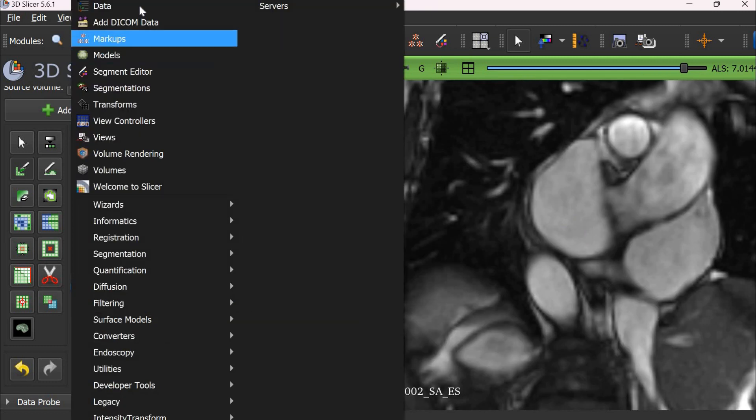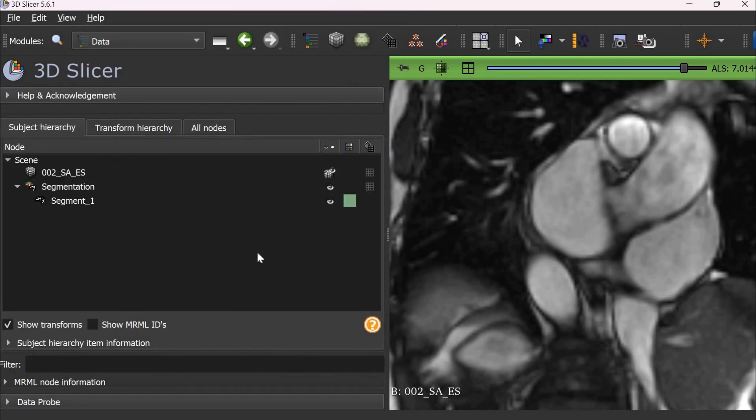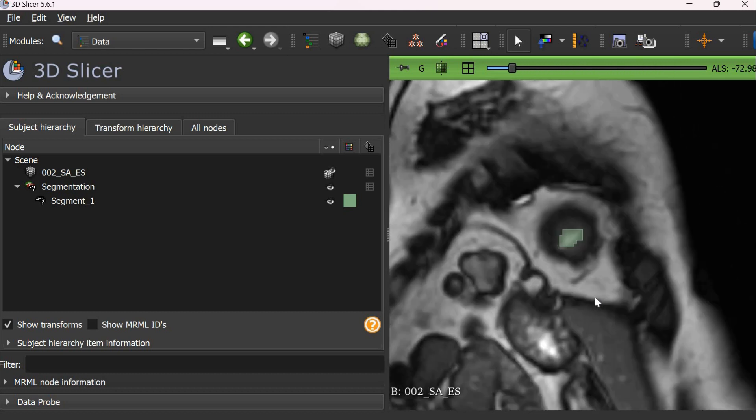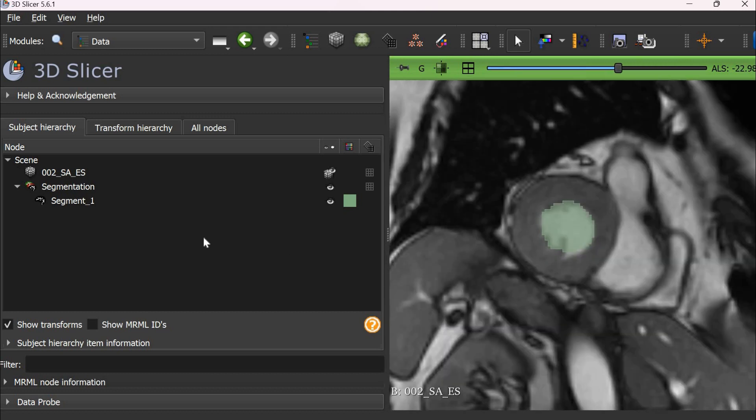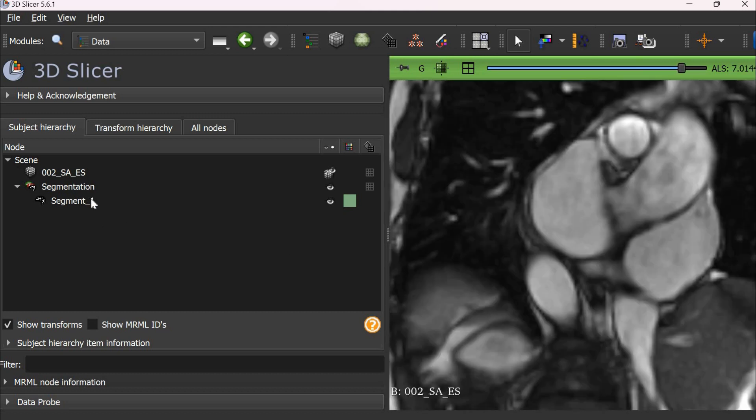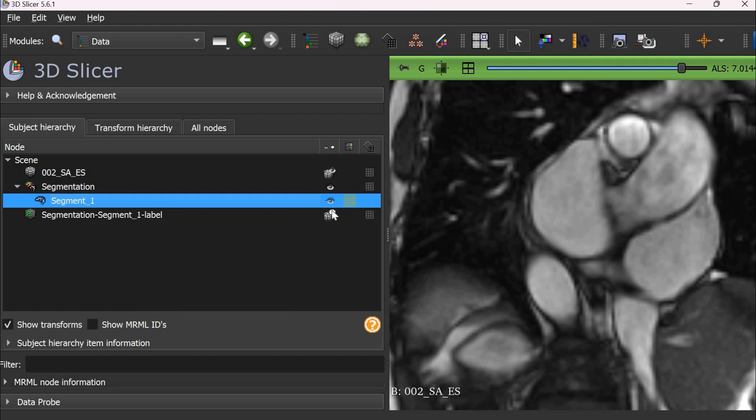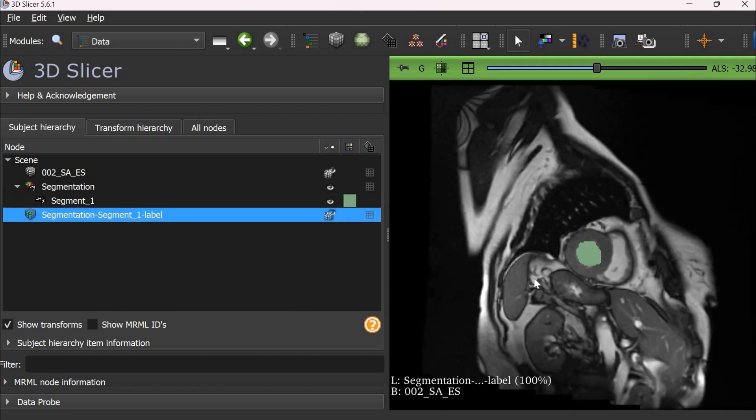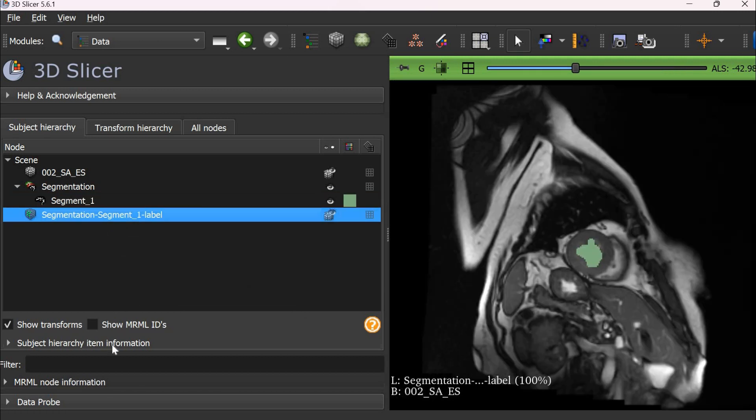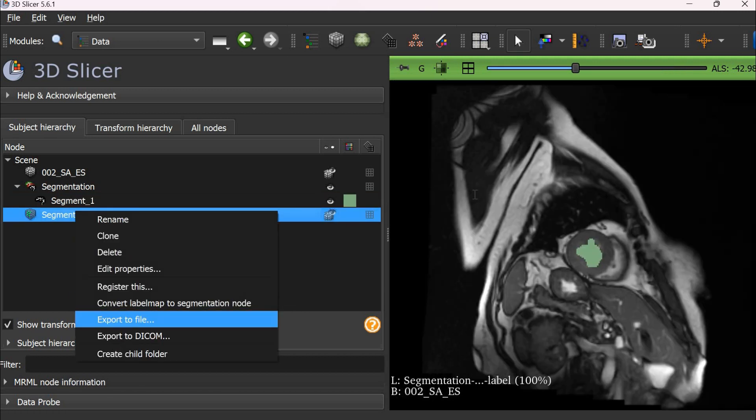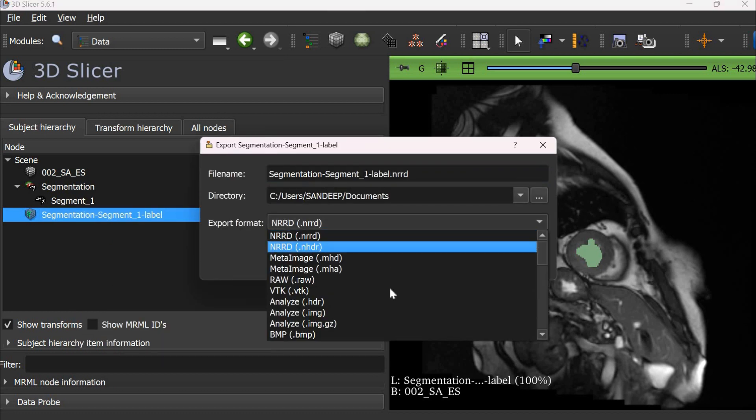To save the files, we go to data, select the segmentation and right click export to binary format first. And then we export the binary map to any format which we like such as nifty, nrrd, dicom, etc.